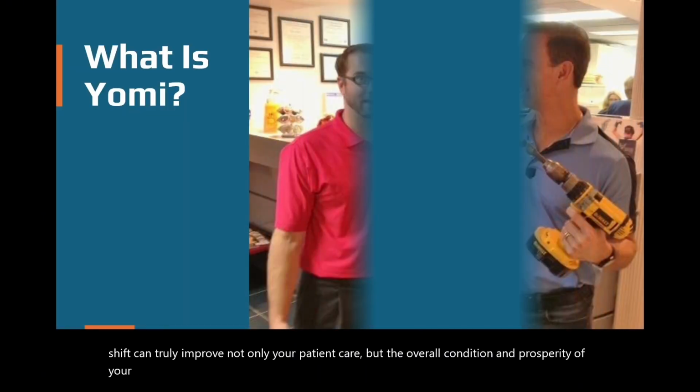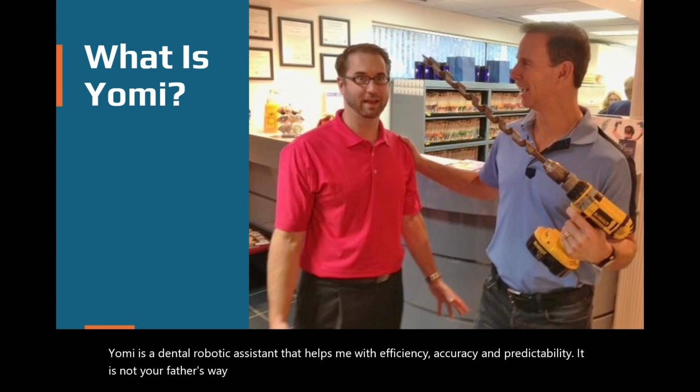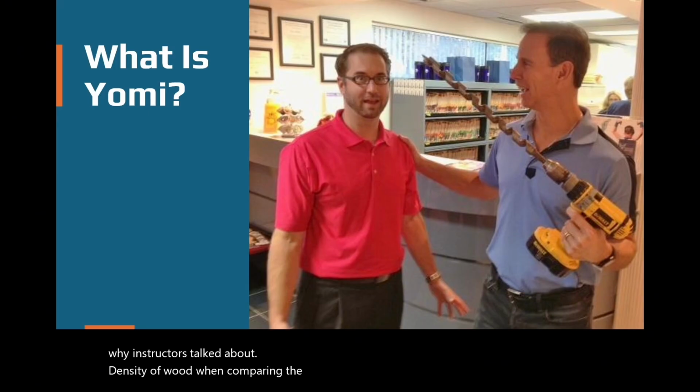So first, an overview. YOMI is a dental robotic assistant that helps me with efficiency, accuracy, and predictability. It is not your father's way of placing implants. Comparing when I started placing implants back in the 90s to what we do today, it's quite apropos to call the 1990s the Black and Decker days of implant dentistry. It is like putting wood screws into wood. Maybe that's why instructors talk about the density of wood when comparing the types of bone, D1, D2, and so on.